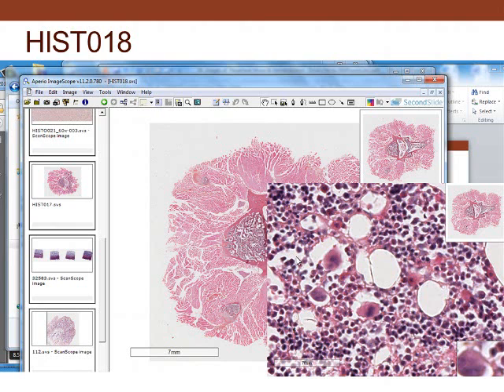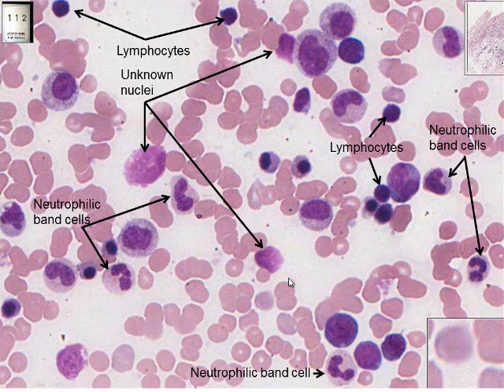So bone marrow is a source of platelets, and also it's a source of blood cells, both white blood cells and red blood cells. So here we can see we can't identify all the cells. You can see there, this is in bone marrow. You can see lymphocytes in through there.